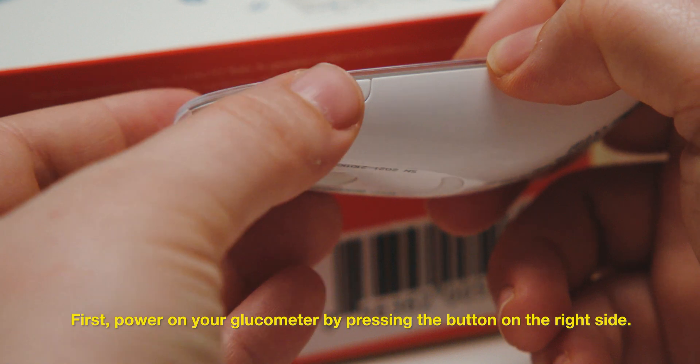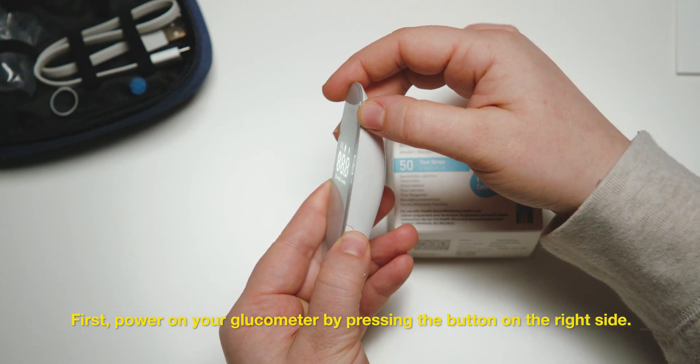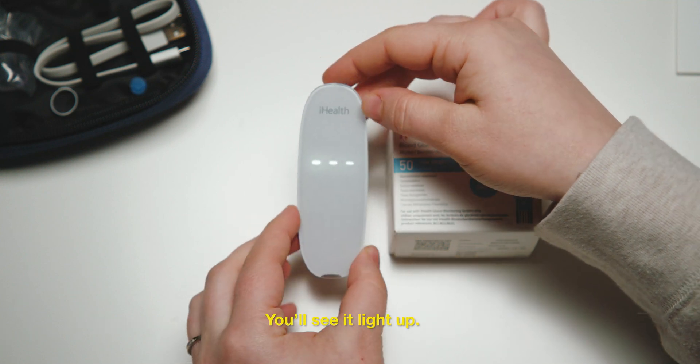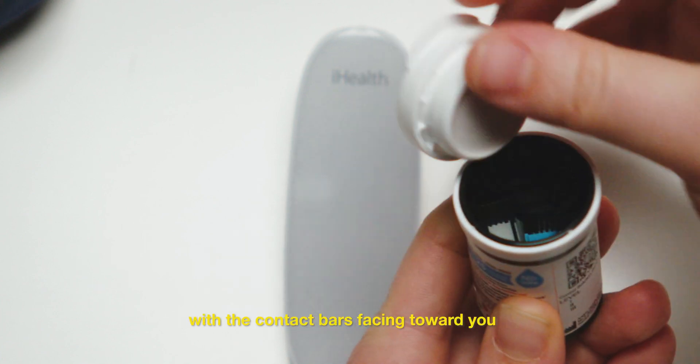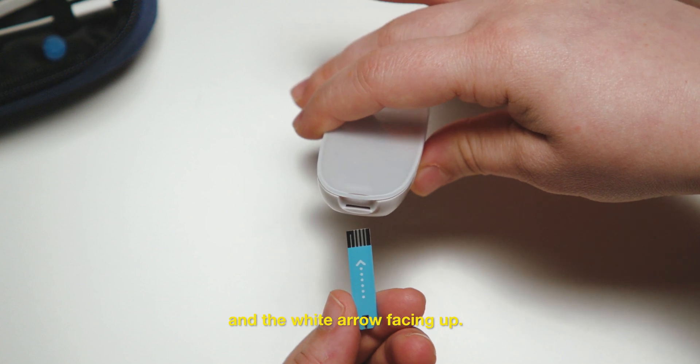First, power on your glucometer by pressing the button on the right side. You'll see it light up. Insert the test strip into the meter strip port, with the contact bars facing toward you and the white arrow facing up.